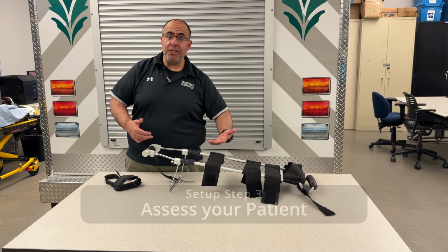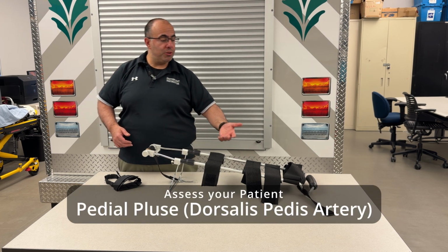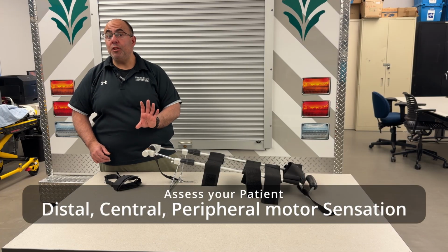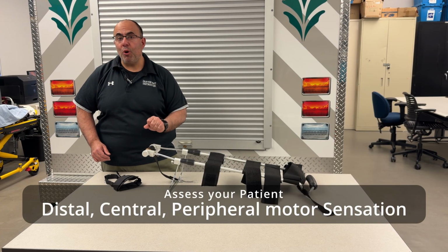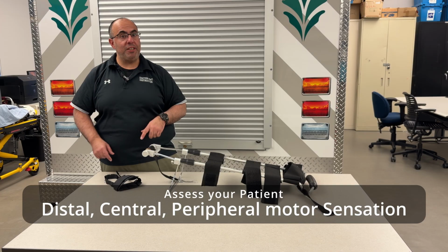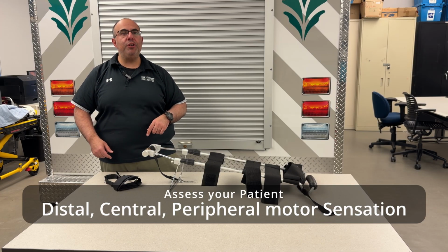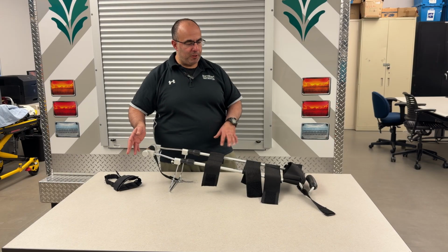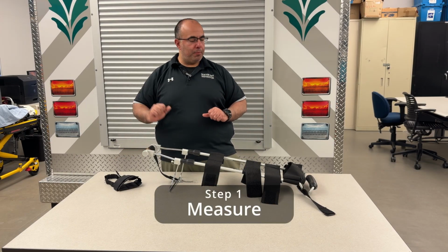And as you're applying that manual traction, when you started off at manual stabilization and manual traction, you're assessing your patient. You're assessing those pedal pulses. You're assessing that popliteal artery. You're making sure he's got good distal motor sensation, or central motor sensation, or peripheral motor sensation. Whatever your instructors are telling you to use, and whatever the textbooks that you're using tell you to use to assess that patient. Now we have the ankle hitch on our patient.